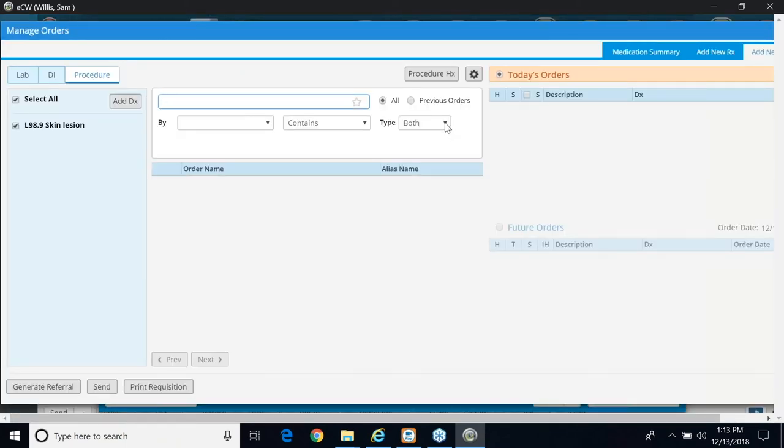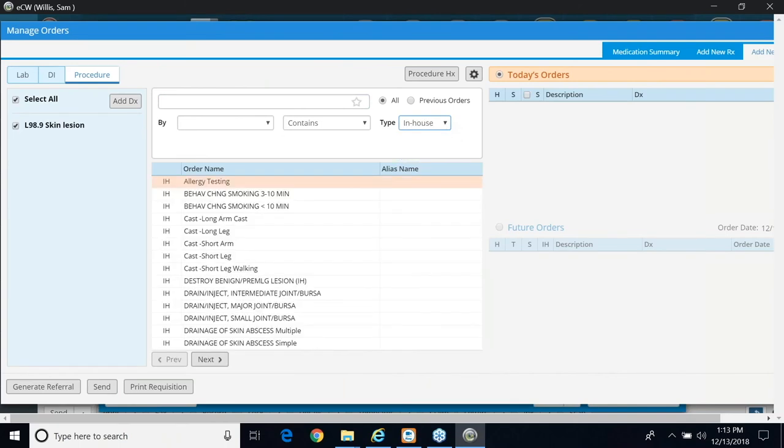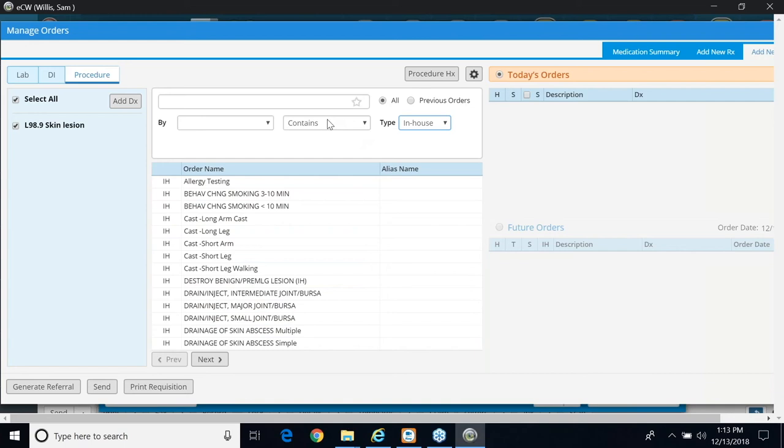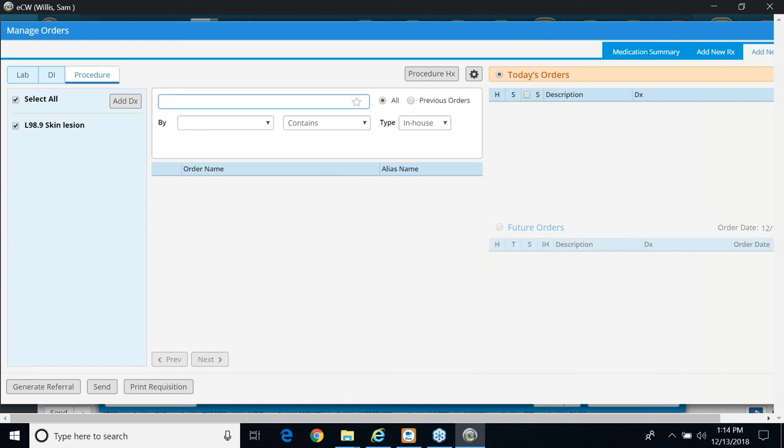Again, if I click on in-house, I still have to search for it because it's not displaying. I mean, it is right here, but I could also do my contains, and I could search for lesions this way. So here it displays, and I don't believe I added it to my favorites either, but I could do that as well.